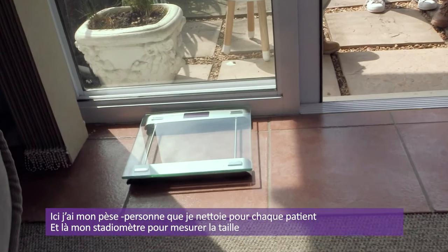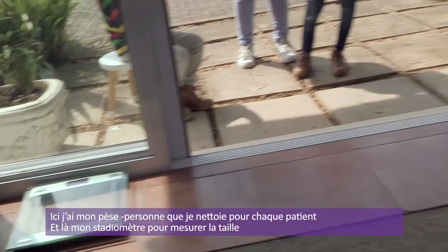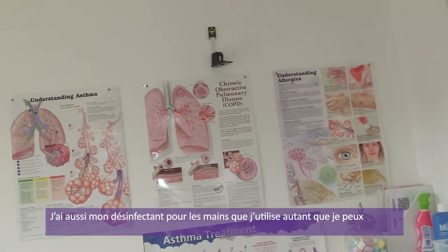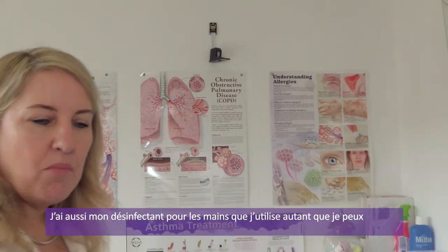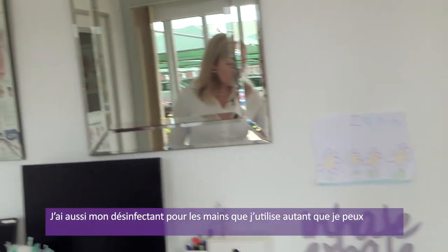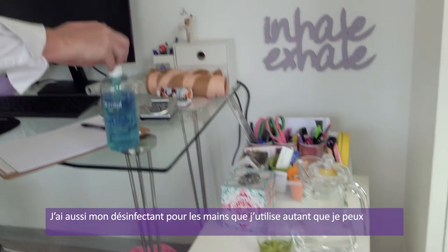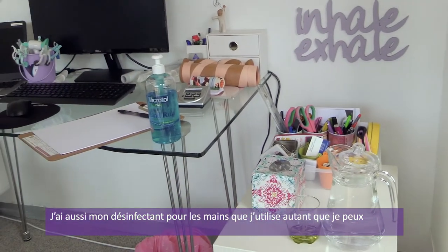clean it for every patient. I have my stadiometer all ready to take a height. And then importantly as well, I have some water for the patient over here and some tissues should they be coughing. I also have my hand sanitizer, but you can use it every opportunity.